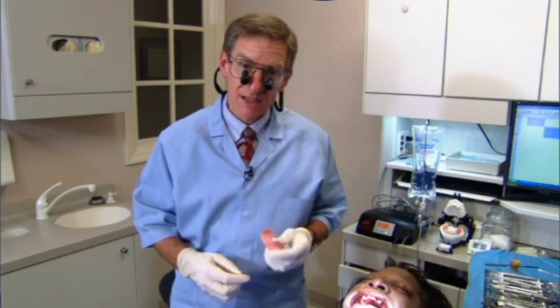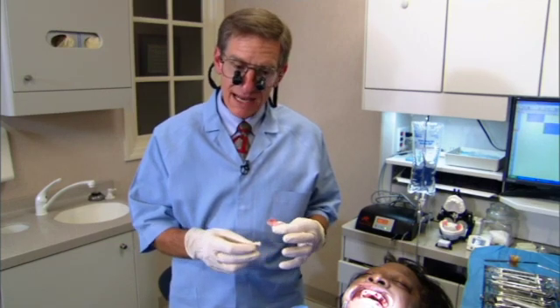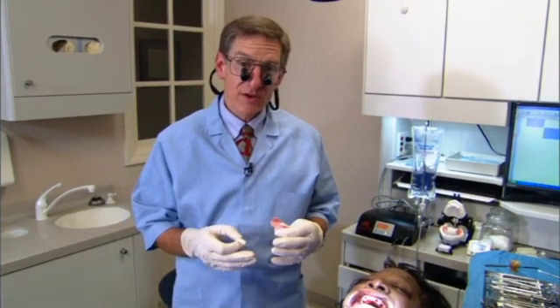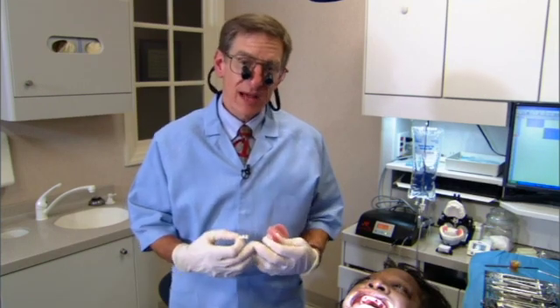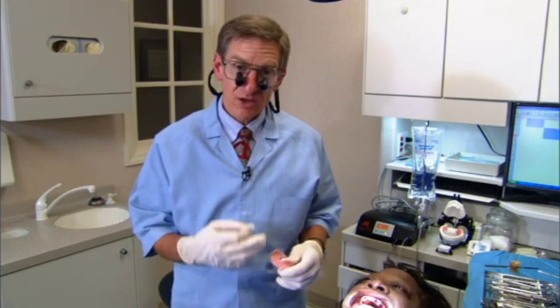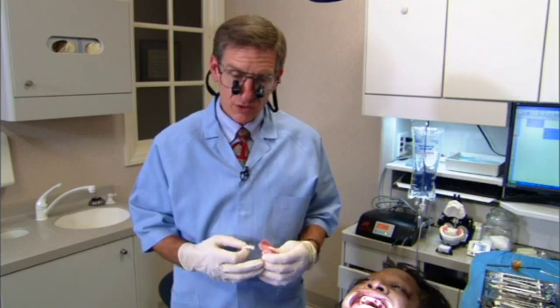Now let me tell you about the temporary partial. I've made it fit to the provisionals, and I've made it so that she can wear the partial when we get ready. I'm going to prefer that she not wear the temporary partial for about a week because I don't want to load up those implants that I've just put in. I just don't feel good about the acrylic pounding against it. And if I can protect them for the first week, 10 days, 2 weeks, I'd feel real good about it.